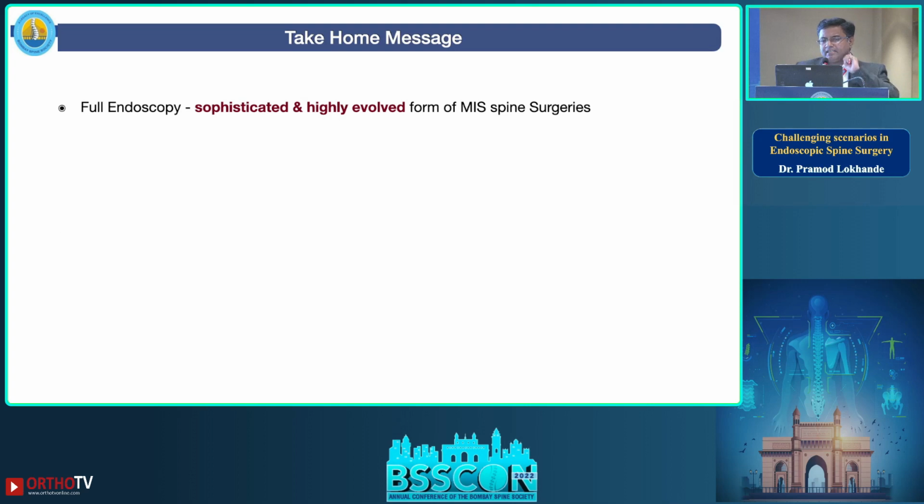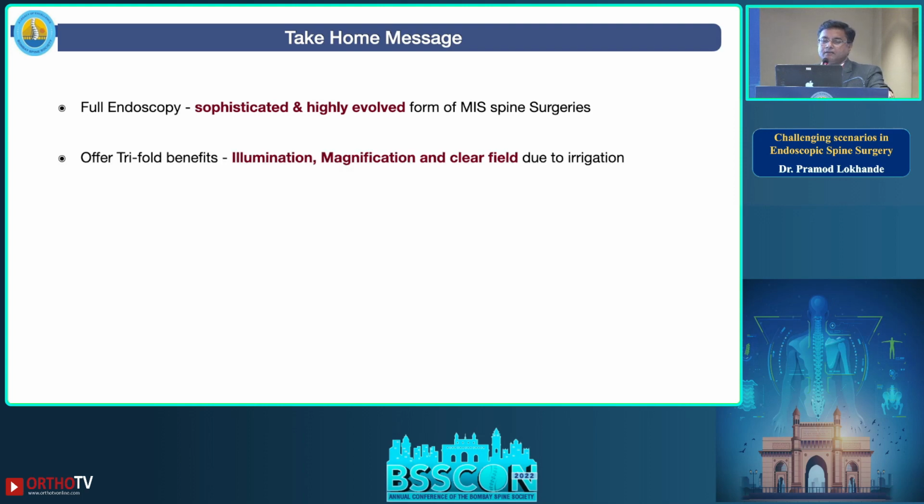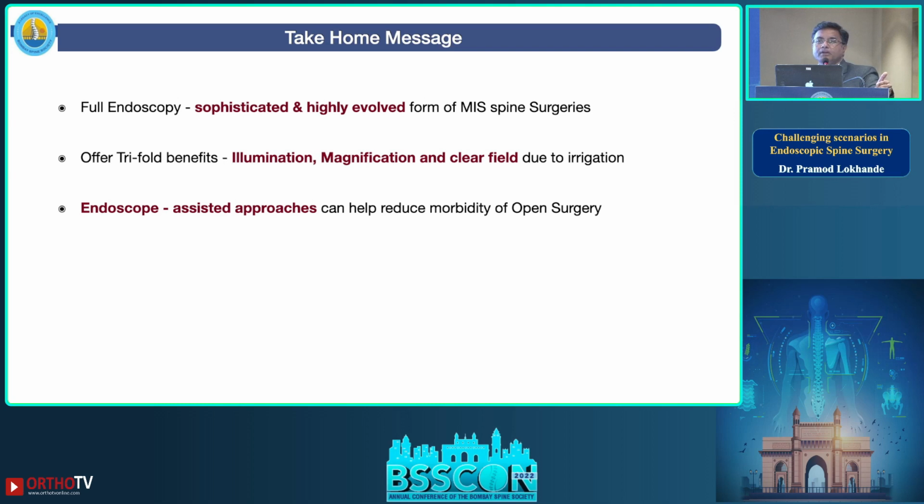So the take-home message is, full endoscopy is a sophisticated and very highly evolved form of MI surgery. It offers trifold benefits of illumination, magnification, and a clear field of vision. And it is possible for us to take away some part of open surgery by doing endoscopic assisted procedures or approaches. So part of the surgery can be endoscopic and part still can be open surgery.